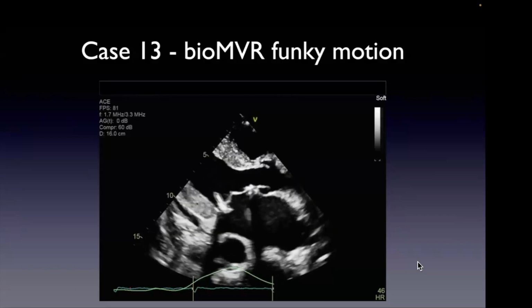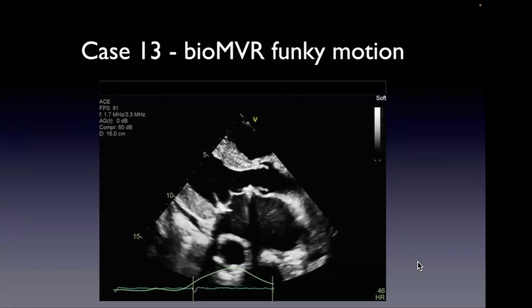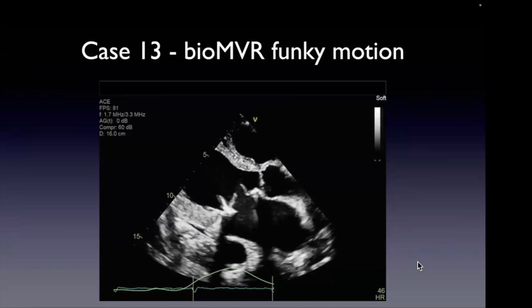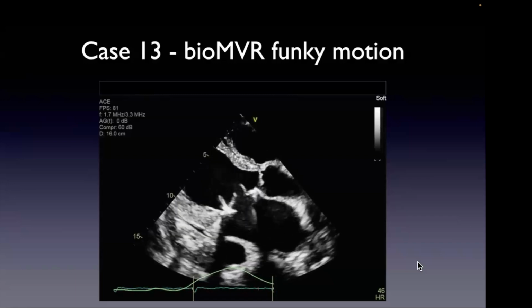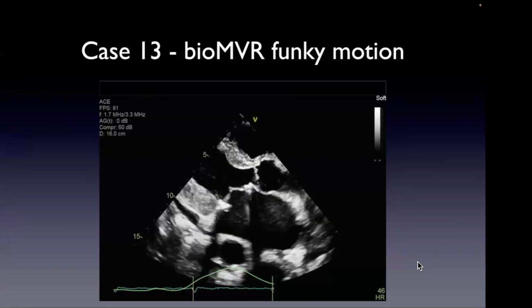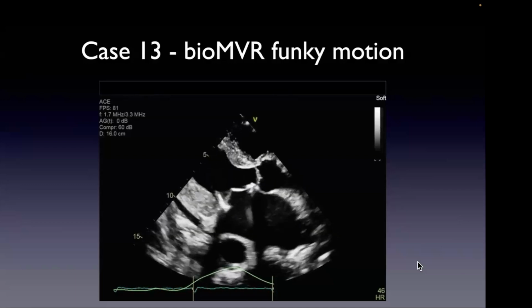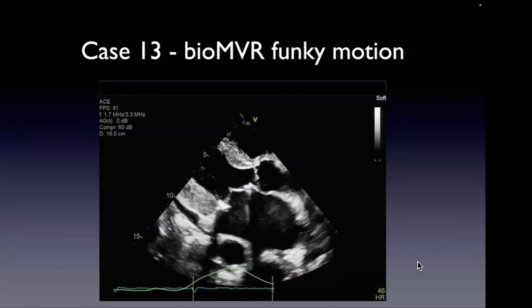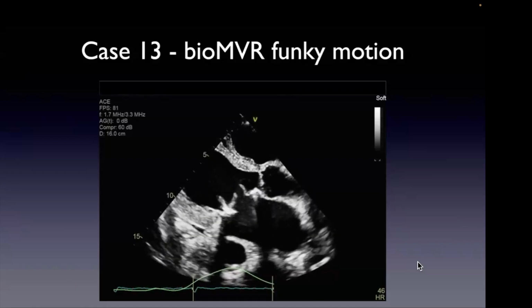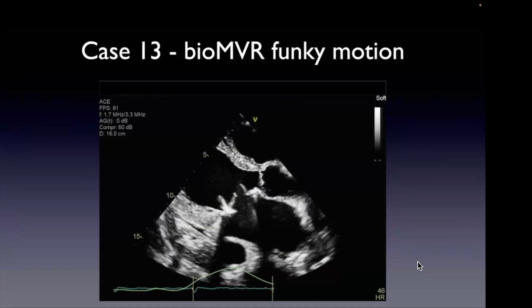Mechanical valves, right? The bileaflet occluders, right? So I have a whole bunch of collections where they dance, they go like this. But I've never seen it with a bioprosthetic valve. This is kind of weird. Dance. It's like, what? Probably has to do with filling of the ventricle in diastole. It's kind of cool. It's mesmerizing, eh? It's a dance.